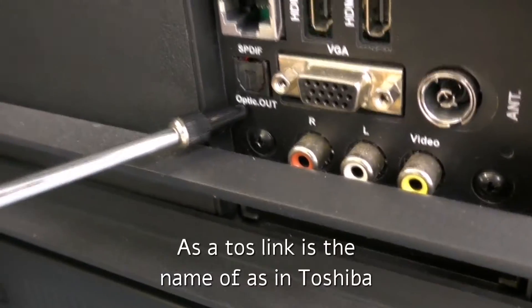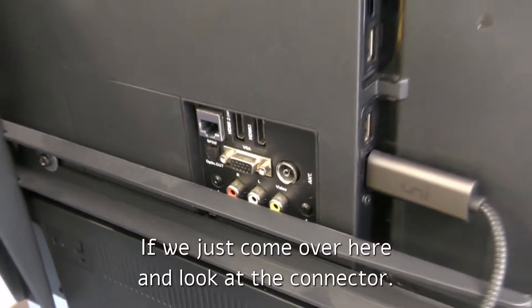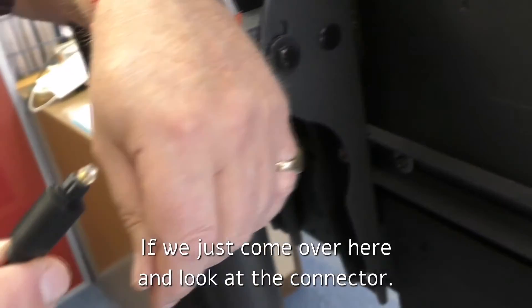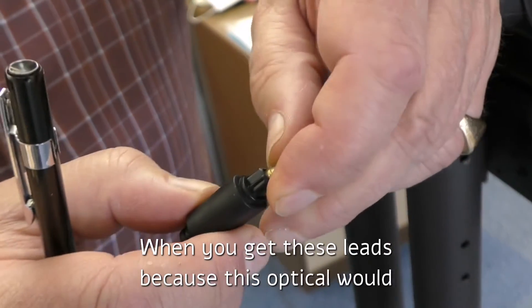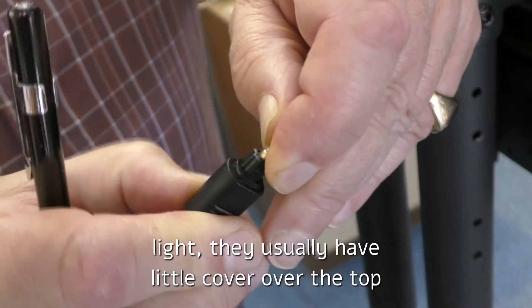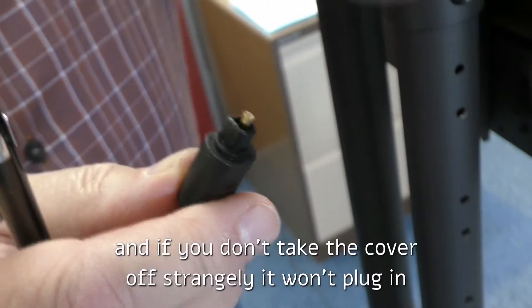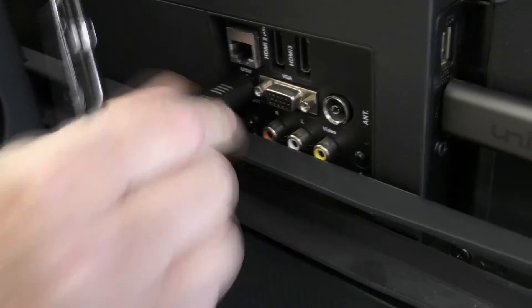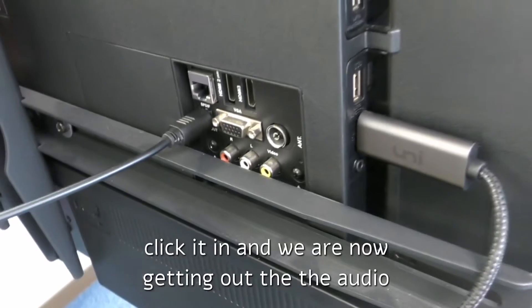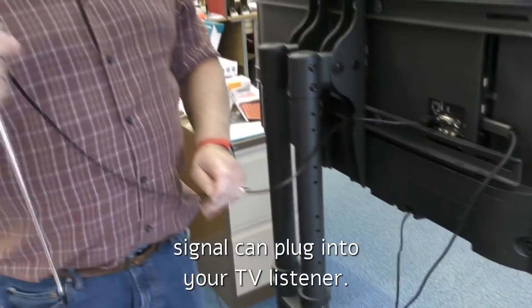It's officially known as a Toslink — as in Toshiba. Now, there is one little trick: when you get these leads, because it's optical and uses light, they usually have a little cover over the top. If you don't take the cover off, strangely, you won't be able to plug it in. So to connect into that, we simply plug in, click it in, and we're now getting out the audio signal that can plug into your TV listener.